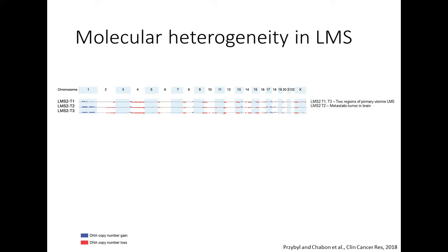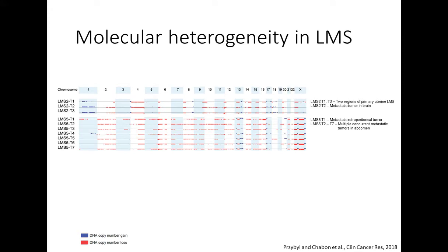And based on genomic profiles of the samples, you can see heterogeneity within the primary tumor, which is indicated by selected copy number gains or losses that are being present only in certain region of the primary tumor and not in the other. For example, in chromosomes 1 or 2.